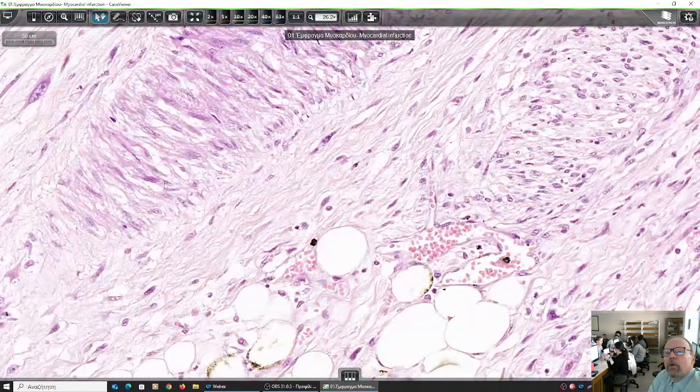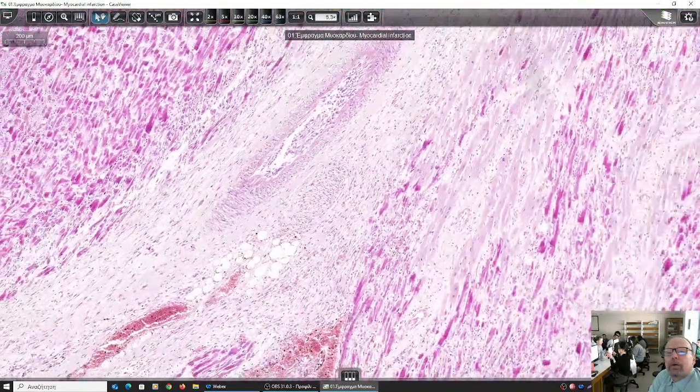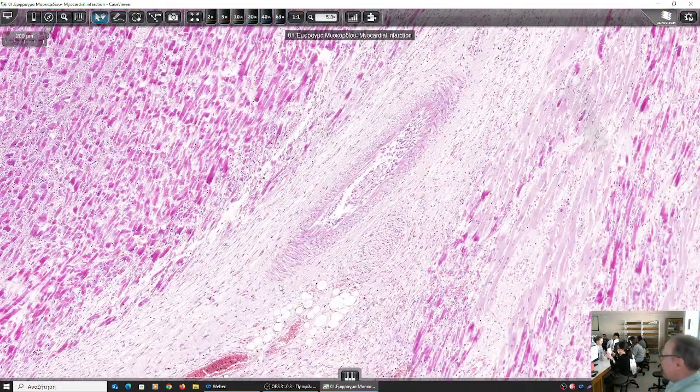So, what is this here? What does this mean for the duration of the inflammatory process? Something chronic. Chronic, yes, that's right. So this is chronic inflammation leading to scar formation. That means that the patient had suffered from myocardial infarcts in the past. However, he had survived that infarction. Unfortunately, on the background of the old infarct, a new infarct was set, and this proved fatal. That's why we have the autopsy specimen of the heart of the patient.